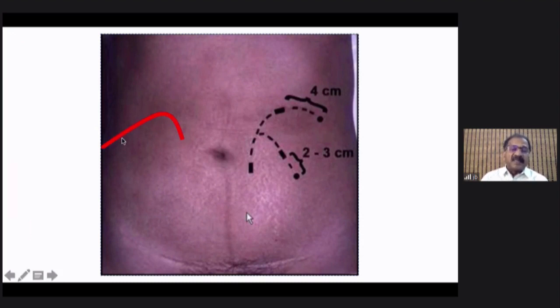So when I say lateral placement of catheter, it doesn't mean that you'll have to puncture here or put in the inner cuff there. You can have the inner cuff just in the rectus sheath, in the lateral part of the rectus sheath, and the tunneling you can bring it nicely and bring the catheter somewhere here, because it is not this which is going to matter when somebody is prone, but the exit point. So I think it may not be a very difficult affair to modify our technique to suit the COVID patient.